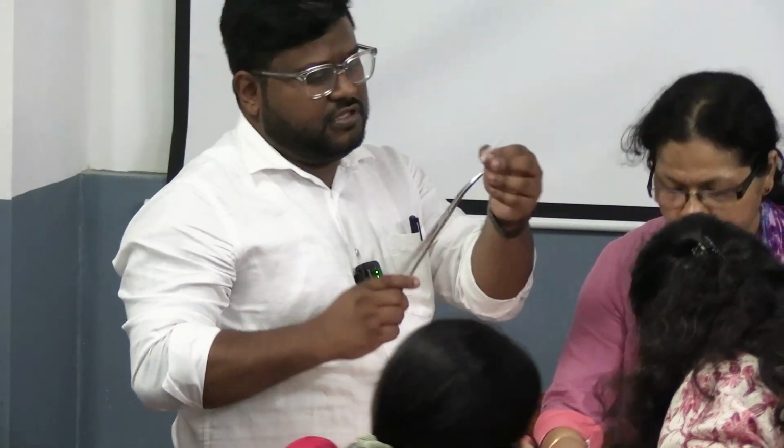Now imagine this is your PPIUCD, okay? You're holding it with the Kelly's forceps. Use your left hand, someone else will support this. Your non-dominant hand is holding the anterior lip. You're going in between the anterior and the posterior lip.